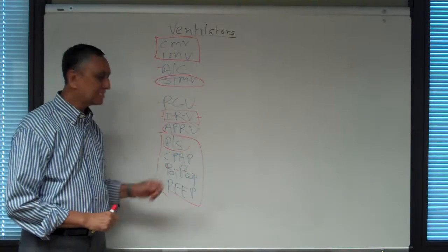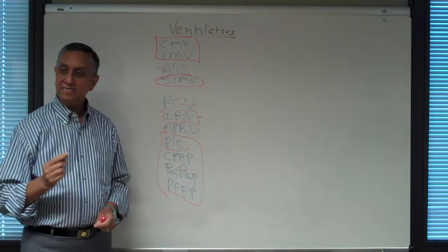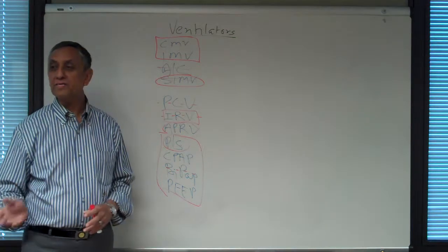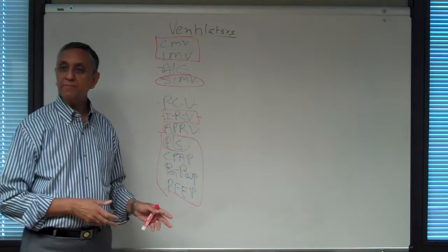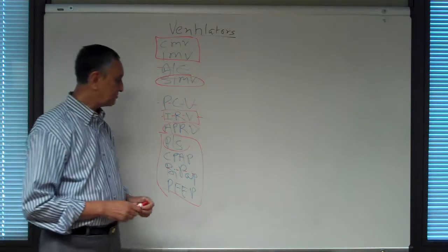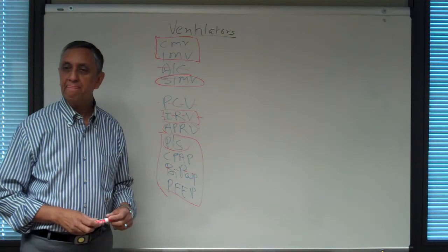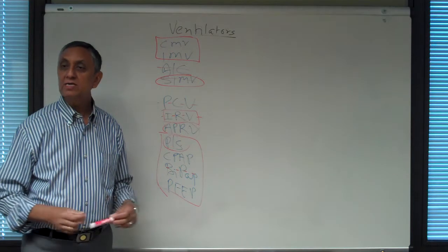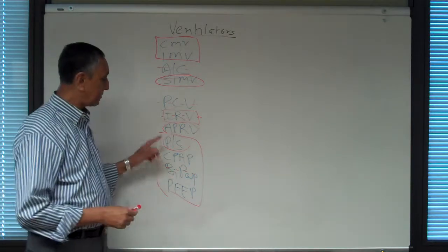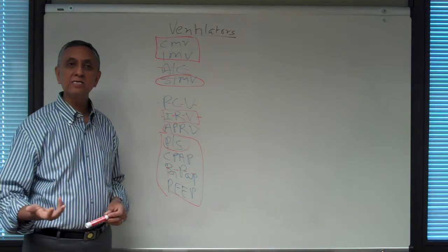Okay. Let's address CPAP first. Another element between the two, they are the same. And yet, CPAP is the term that you use when patients are breathing on their own, spontaneously breathing, while PEEP is the term that you use when they are being mechanically ventilated. Now, I'll draw it for you. Which function of the lung do both of them help? Oxygenation. They both help with oxygenation. Pressure support actually increases the tidal volume and thereby minute ventilation, so it helps with ventilation.